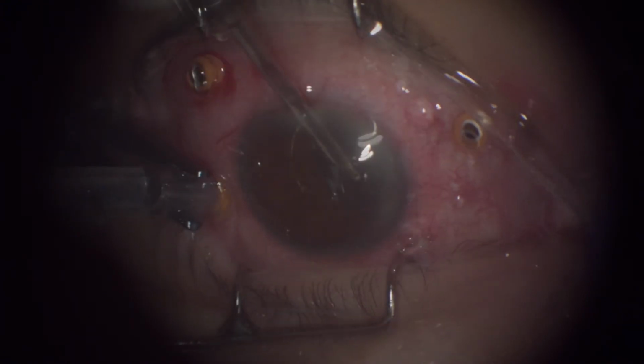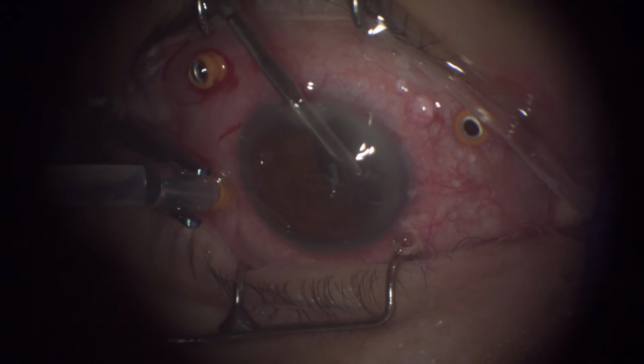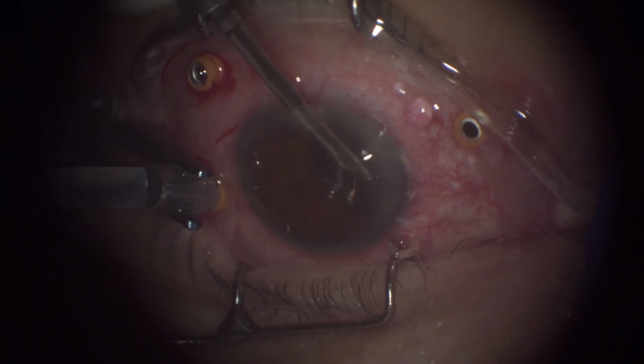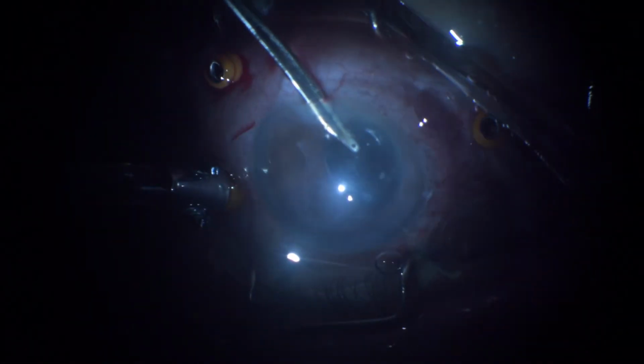Some silicone oil might have come to the anterior segment. We just remove it. You see the pupil is small, but even though the pupil is small, you have a very good view of the posterior pole.